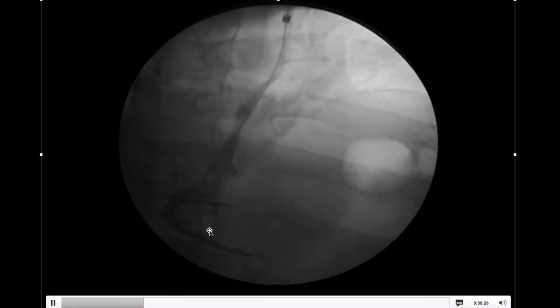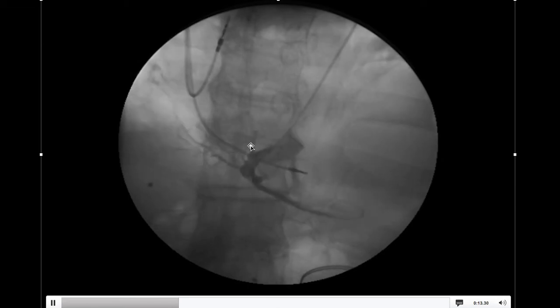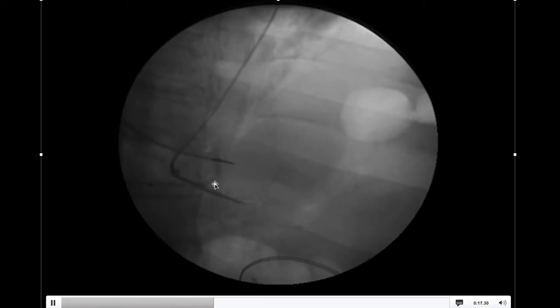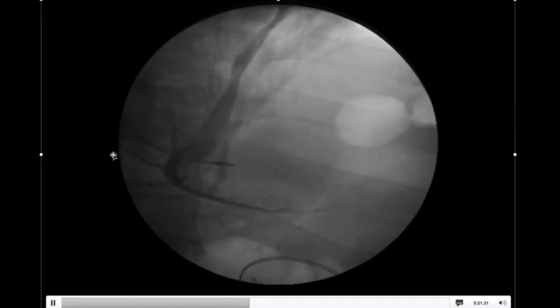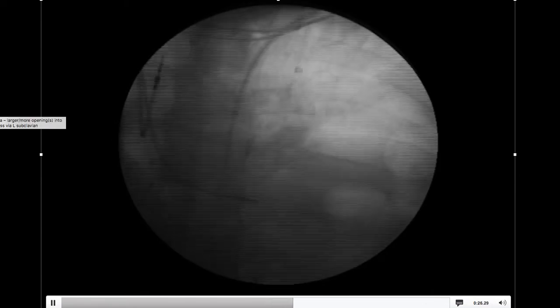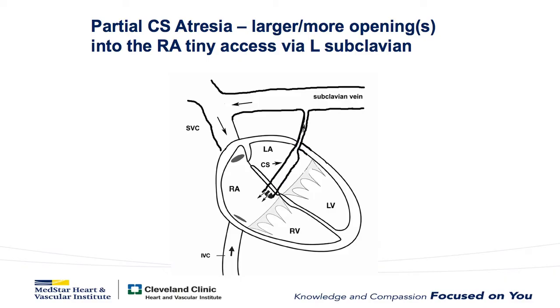When we inject down near the os of the CS, you can see that there is blood return back into the right atrium, but just no way to get from the right atrium into the coronary sinus or vice versa. So we're able to implant going down the vein of Marshall. As more blood return goes to the right atrium, the size of the vein of Marshall gets even smaller.